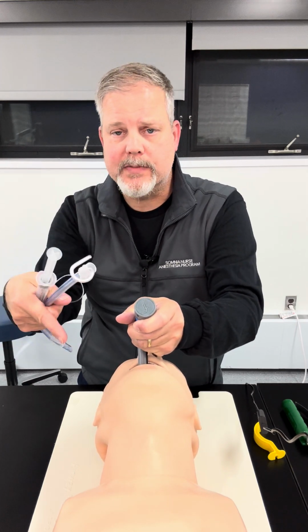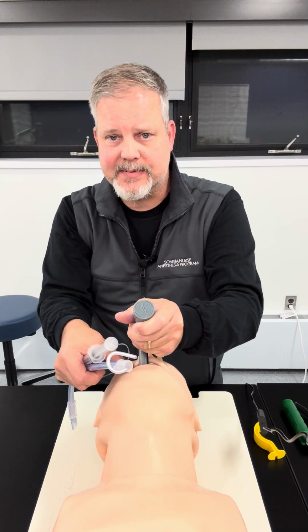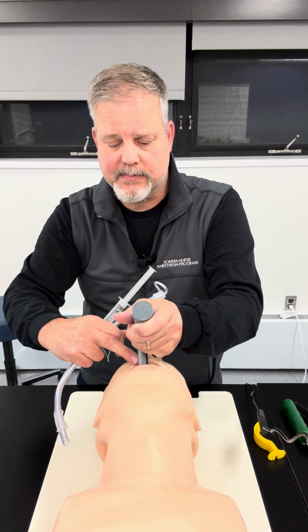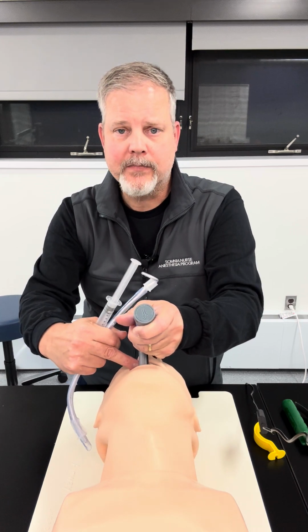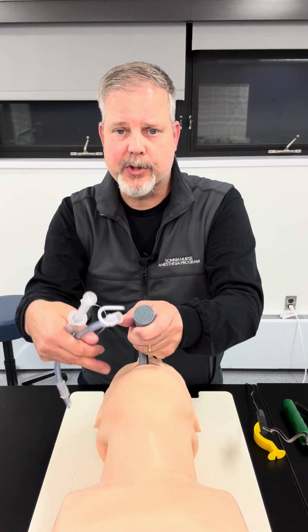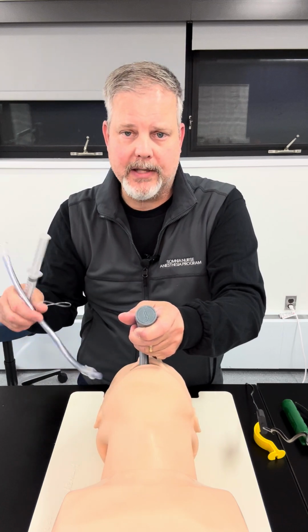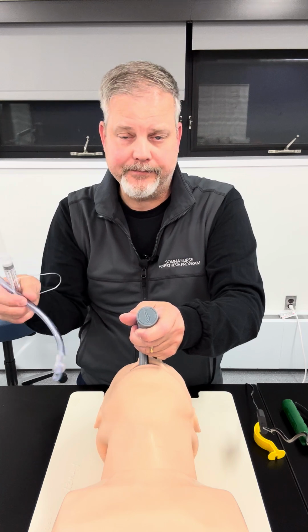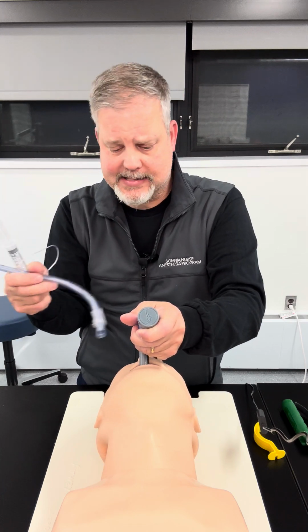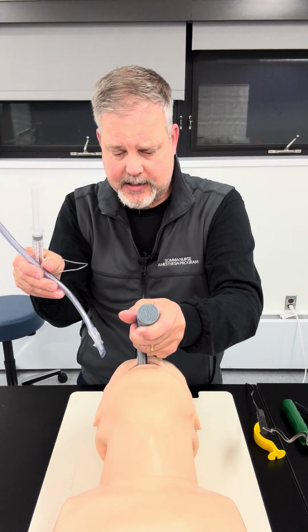Now, during this whole step, what I also want you to make sure you're doing is taking a look at the lips here and making sure that with this blade, you're not pinching the lips against the teeth, so that you're protecting all of this area up here and not causing any trauma to the lips, and you're also not causing any trauma to the teeth. So now I can see that I've got a good view. I'm clear up here, not causing any trauma or pinching on anything.